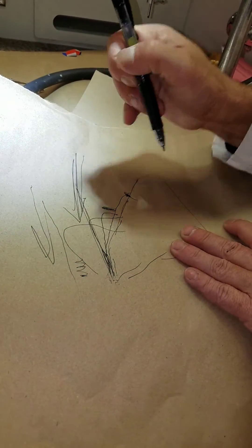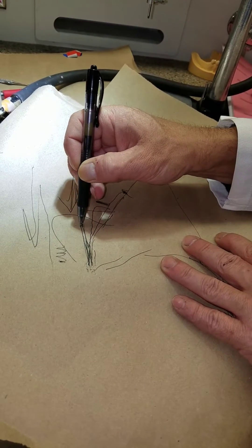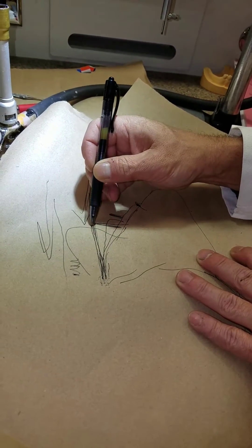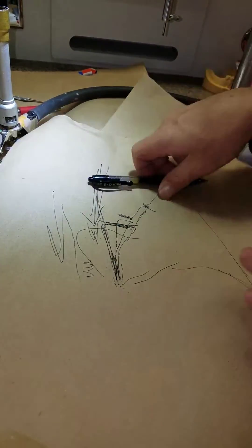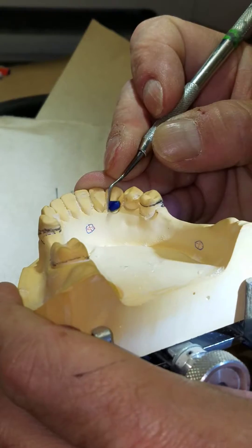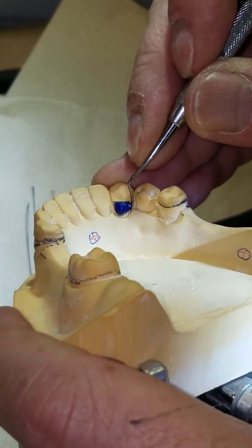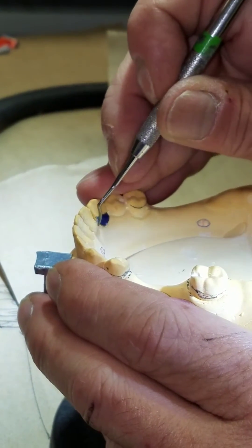Coming out of the sulcus, you're equal to your path of insertion. You need about a millimeter width, but it also has to have that capture capability. I'm going to carve that so I don't have an undercut at the gingival. Use your wax carver — that makes total sense.